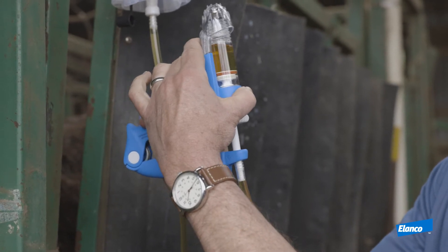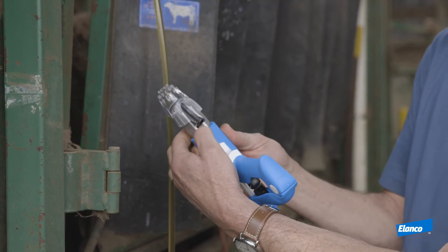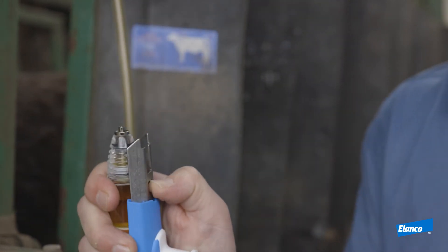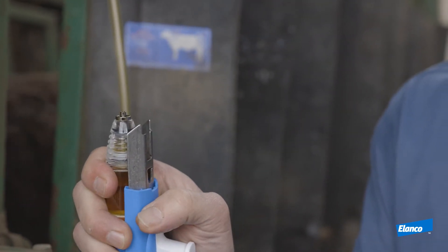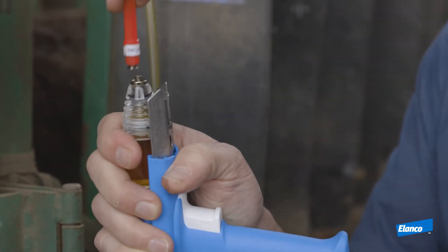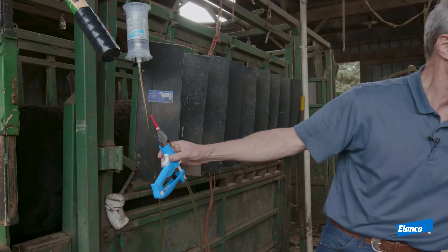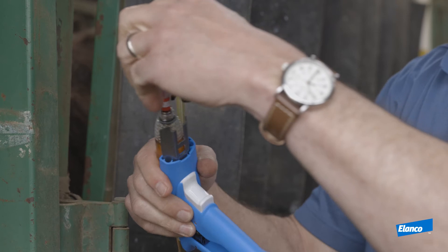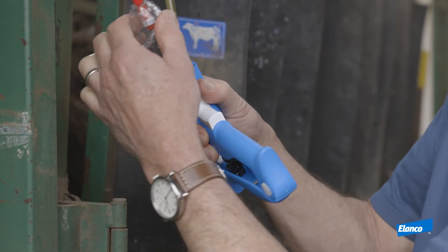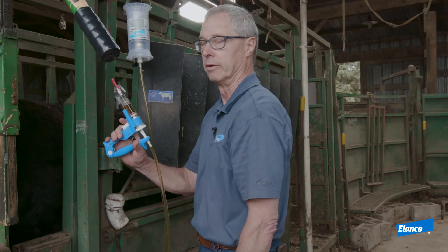Before I put on the needle, I'm going to take the shroud off of the safety cone on the syringe — push this black tab and simply pull that off. I'm going to grab my needle, place it on the syringe, and turn it clockwise until it seats into the syringe. Then I grab my cone again and put it back on until it snaps into place.